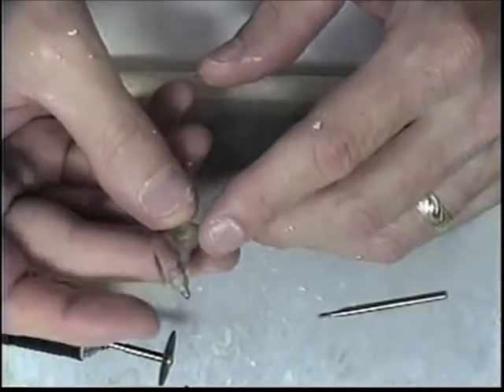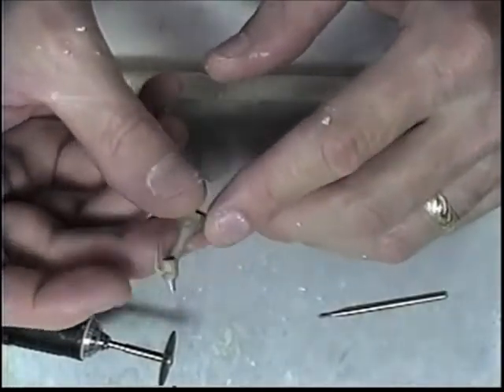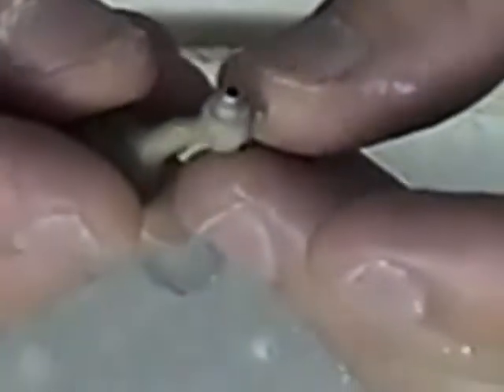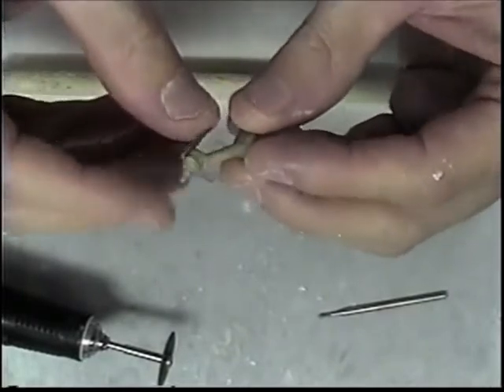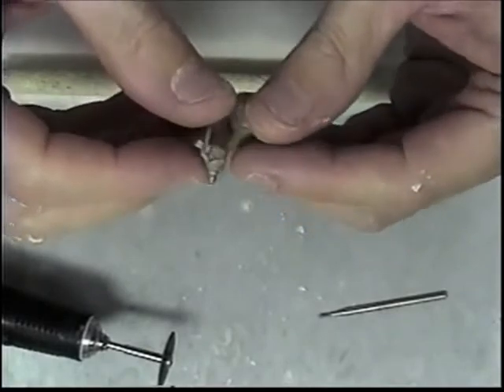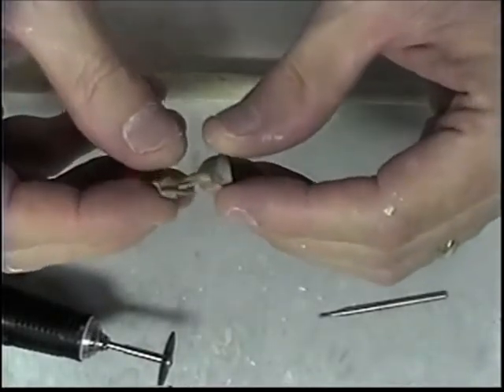Now I have my cast abutment. I've cleaned it up, divested it, sandblasted it, and looked it over and it looks really good. So at this stage I'm ready to cut my sprues off and start shaping it and designing it for this particular case.